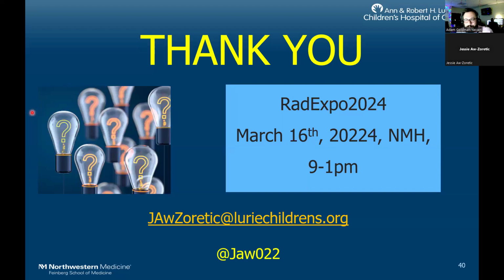Especially when we're imaging a lot of these babies with the feed and bundle technique, to try to image them as fast as possible while they're sleeping, and to not do things that are too loud, which might wake them up. And then we get quite a bit from other non-pediatric centers. They may have already started cooling, so the MRI time frame is variable. It's very hard to standardize, depending on when we get them or what events have been going on.